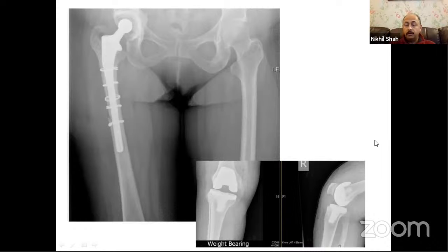But what is important is to appreciate the stem design when we follow this principle. Now, the CARS stem, as you know, has got a slot in the distal portion of the stem. So the 2 cortical diameters rule doesn't quite apply to those stem designs where you don't get cylindrical fixation in the distal fragment. And the same problem happens with your modular stems, which are tapered and fluted. So the fixation is good, but I think the stem is a little bit short.